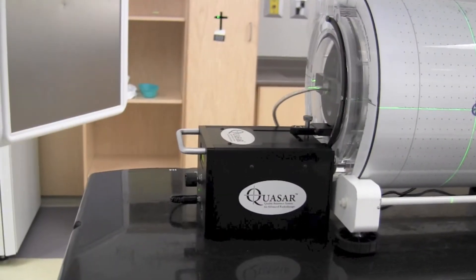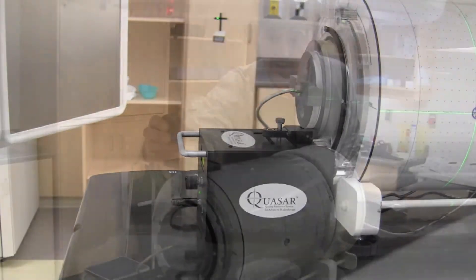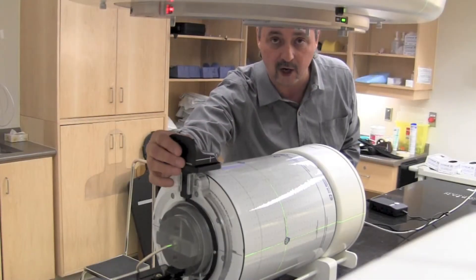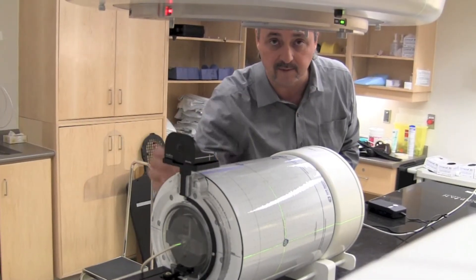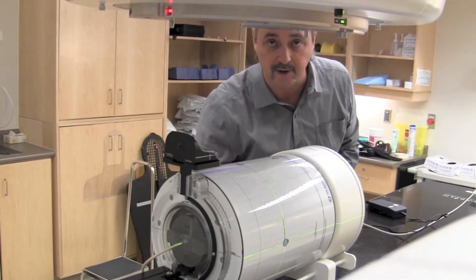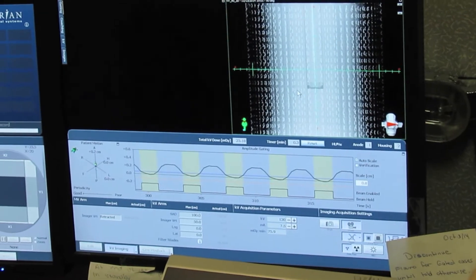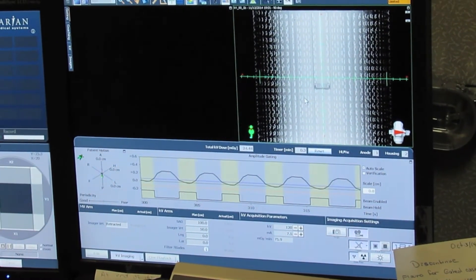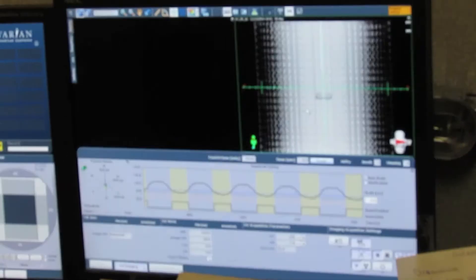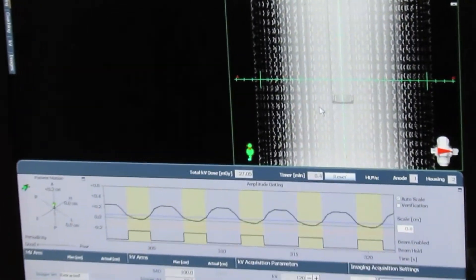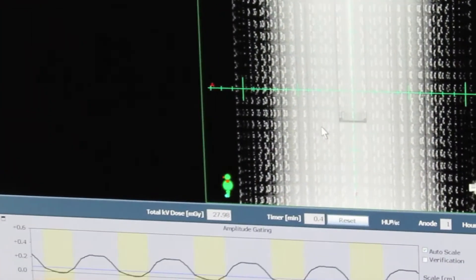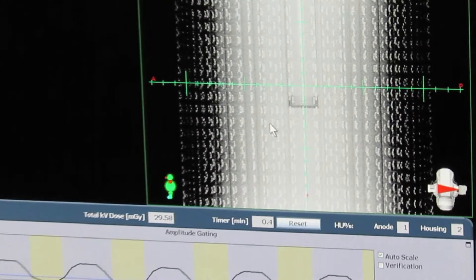We're just about to make some ion chamber measurements. We track the motion. The ArcCheck device is verifying the fluence of the treatment, and the Cylindrical Respiratory Motion Phantom is verifying the motion management technique.